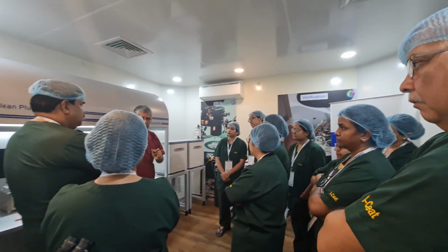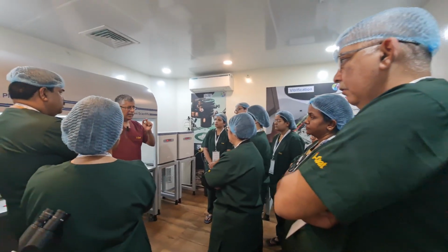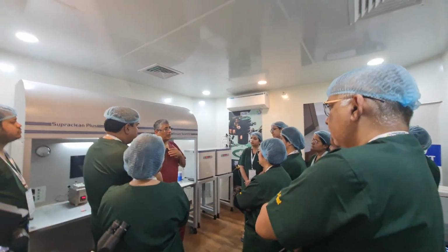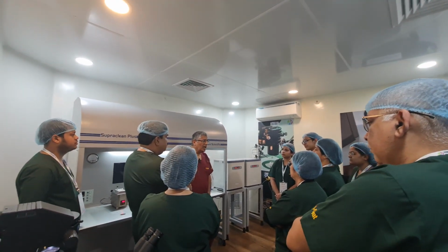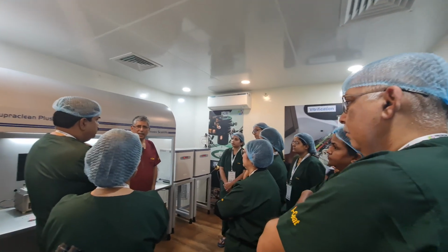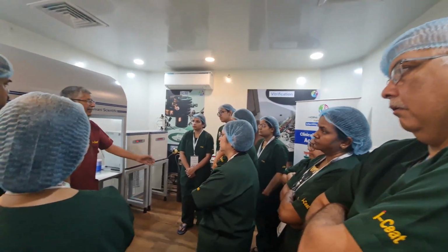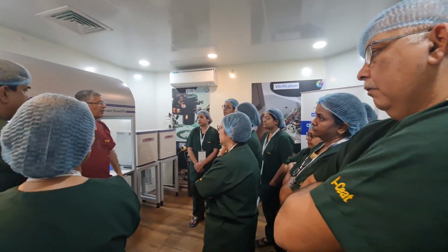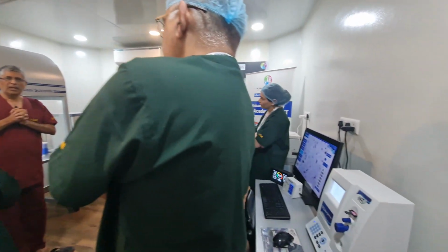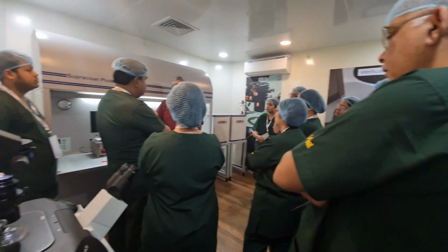So what you need to do is that once you make a lab, think after 8 years, where am I? After 8 years, where is technology moving? After 8 years, everything will be controlled by AI. There won't be anyone like you and me sitting in the lab also. So how many points to be planned, you have to keep in your mind. You start today with 5 cases or 10 cases a month.